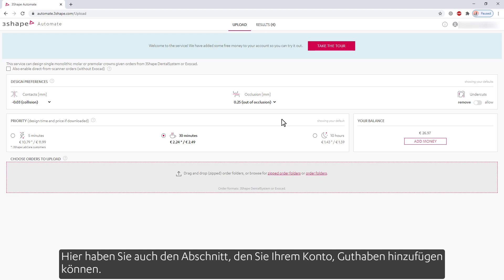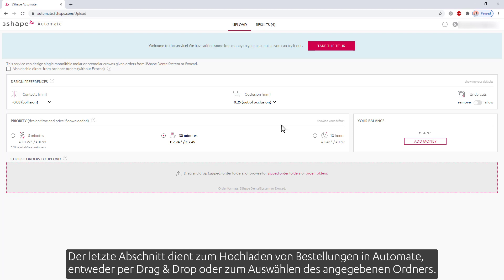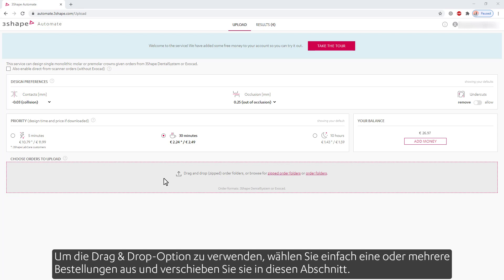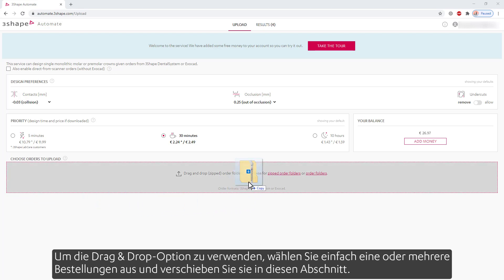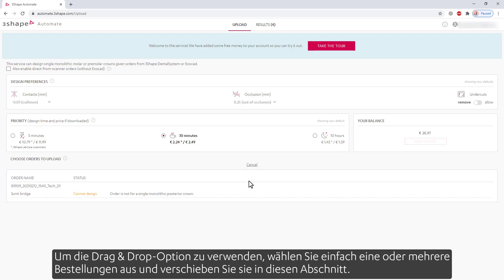In here, you also have the section to add to your balance. The last section is for uploading orders into Automate, either by drag and drop or choosing the specified folder. To use the drag and drop option, simply select one or multiple orders and move them into this section.